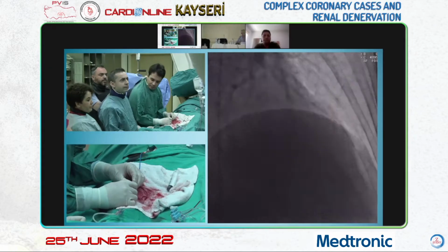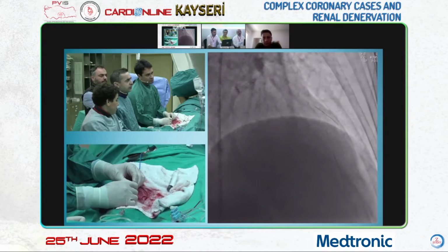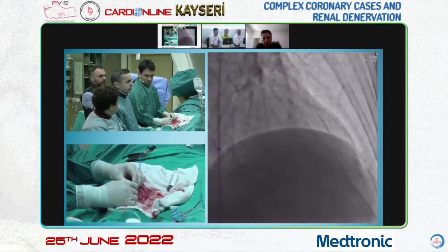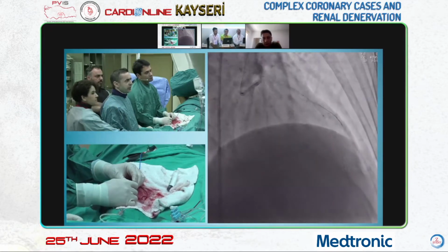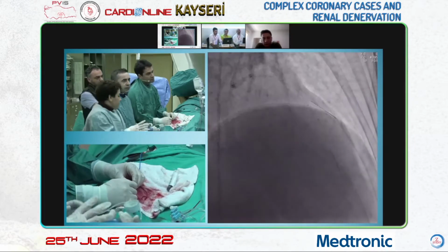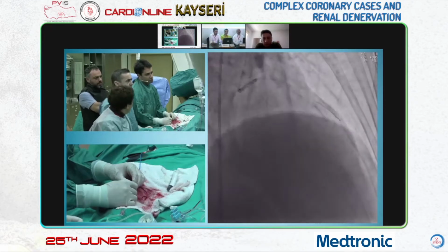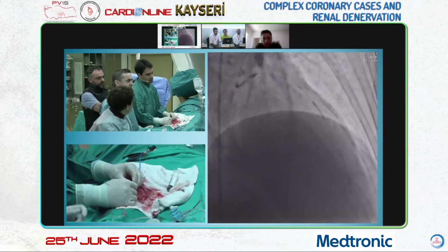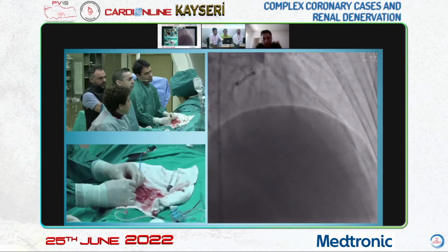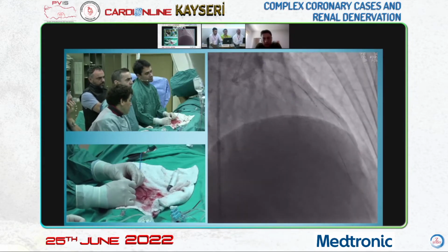Good luck, Nihat. Here from the distal, before starting ballooning, maybe the actual obstruction parts could be ballooned. If the segment is really long, we wouldn't see something. Therefore, without much aggressive operations, we just use it, because we cannot pass the IVUS. I think the vessel would be good because the proximal is really good.